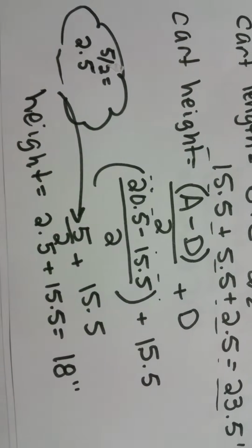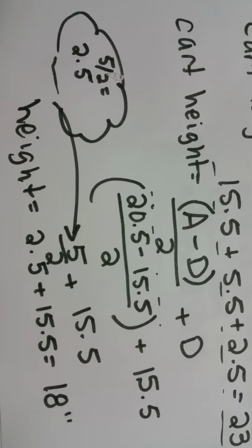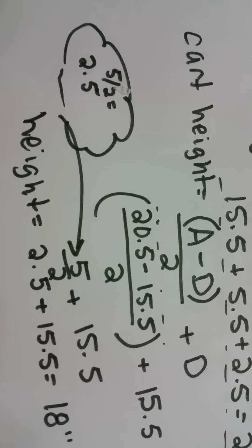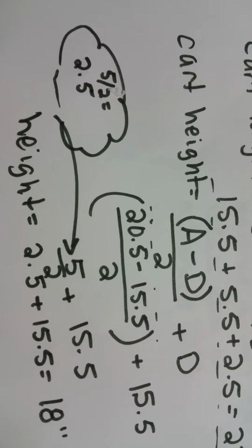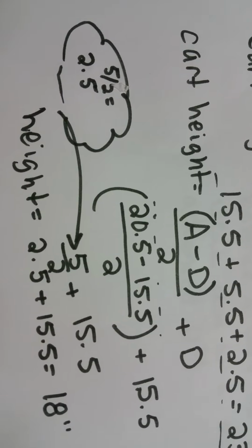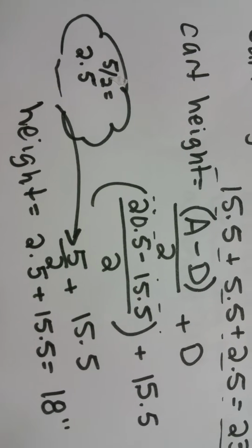So we're doing cart height next. To figure out the height, you want to take the height of your dog at the shoulder, which is measurement A, and subtract measurement D, which is the height of the dog up to the groin. And you go straight from the ground up between their back legs to where you first touch skin. Subtract those two numbers, get that answer, then divide that by 2.